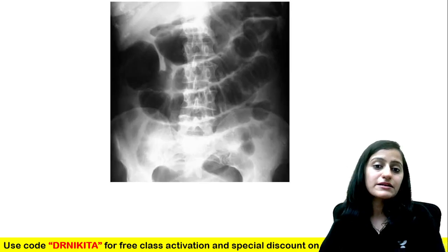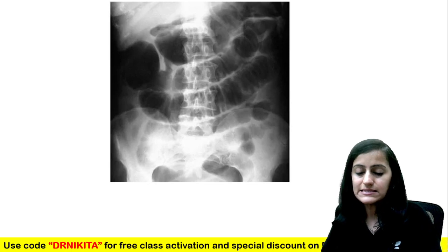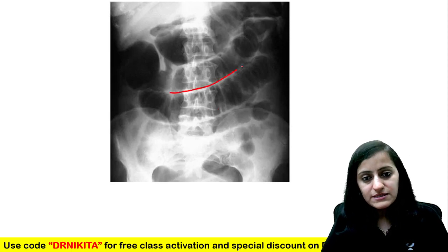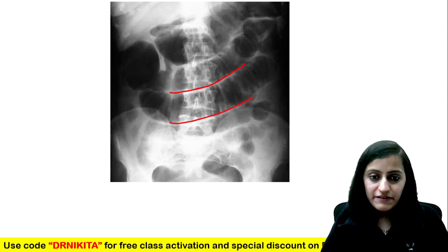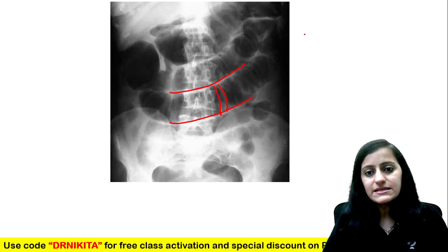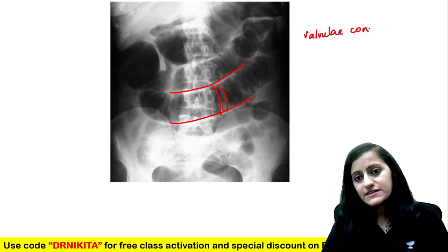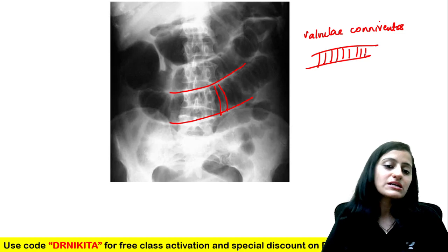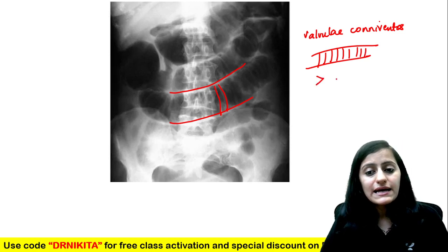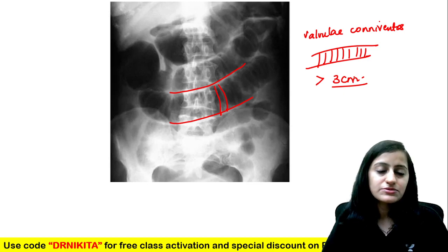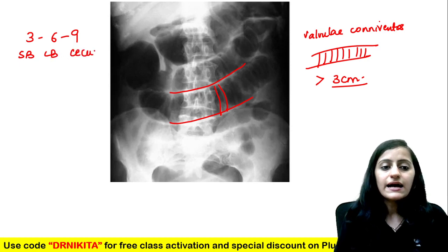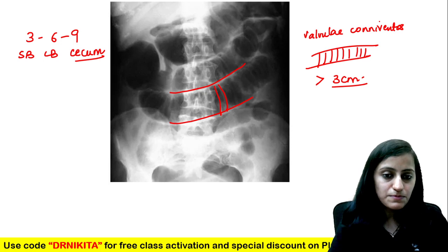Starting with the images, the most important in abdominal radiograph — something which was asked in recent NEET-PG as well — is identifying first the bowel loops, whether it's a small bowel loop or a large bowel loop. This is a dilated small bowel loop — basically small bowel obstruction — where we see dilated bowel loops with complete rings called valvulae conniventes. We call the small bowel dilated when it is more than 3 centimeters. We have the 3-6-9 rule: 3 centimeters for the small bowel, 6 centimeters for the large bowel, and 9 centimeters for the cecum, which is the most distensible part in the GI tract.